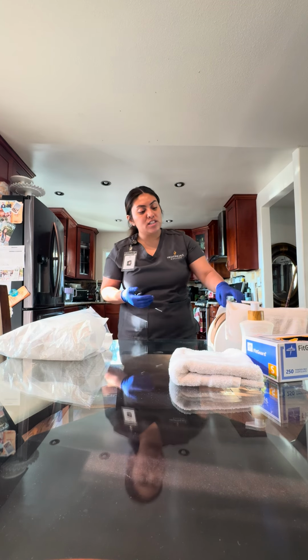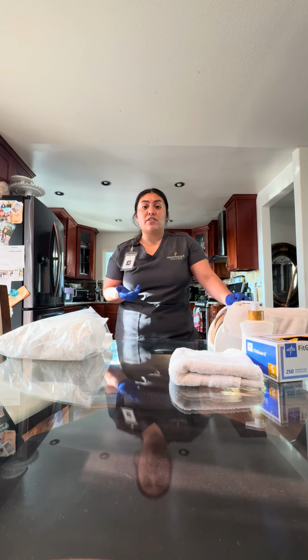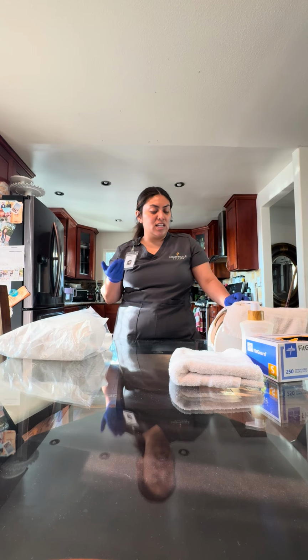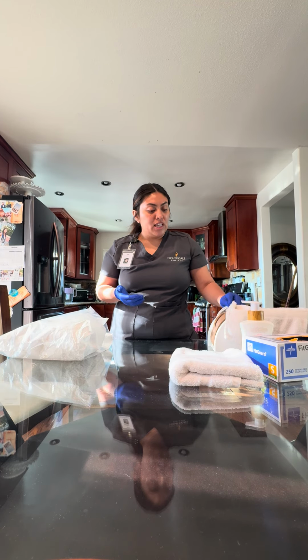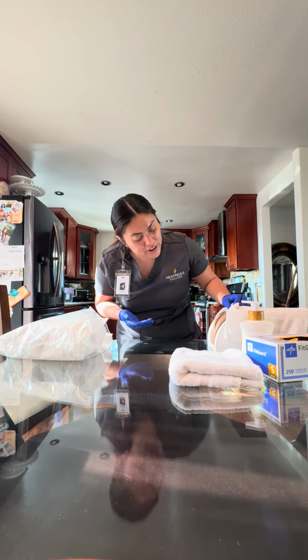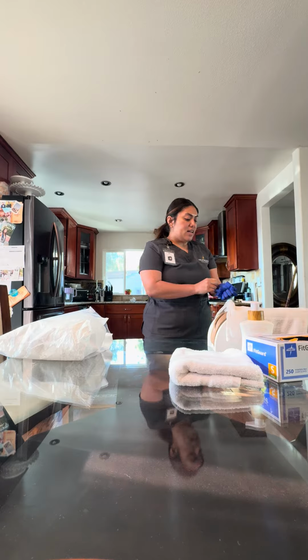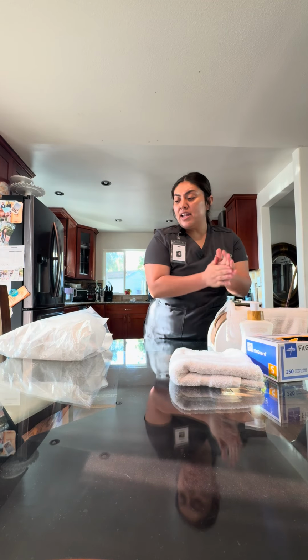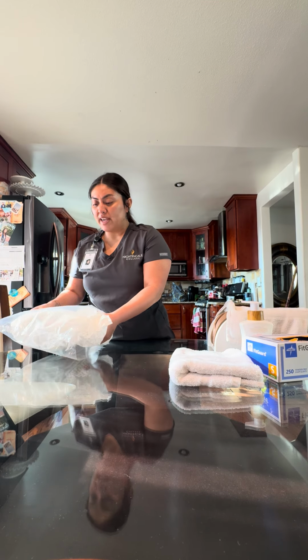Now that my patient is exposed and cleansed, I will be checking for skin integrity. I will be checking for any redness, irritation, inflammation, or discharge. After checking for skin integrity, I'm also identifying the urinary meatus. After identifying the urinary meatus, I am disposing of my gloves, redoing hand hygiene, and obtaining my Foley catheter kit.